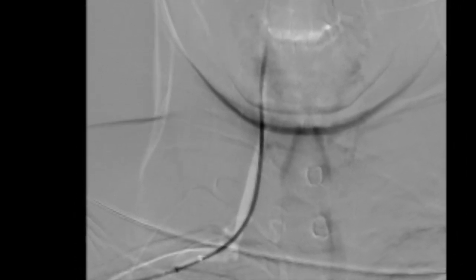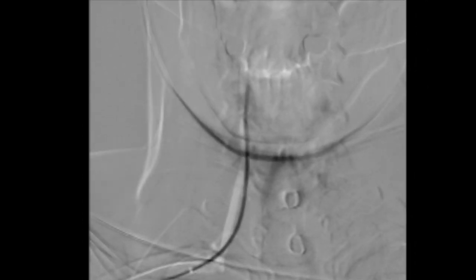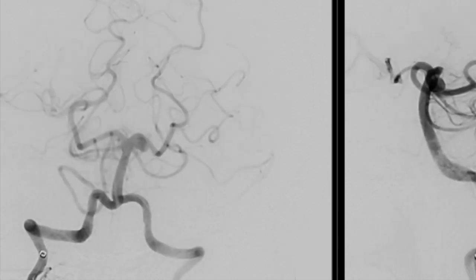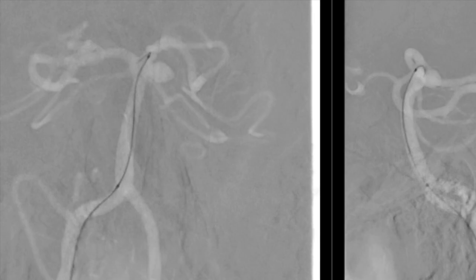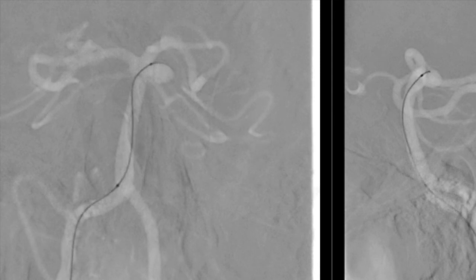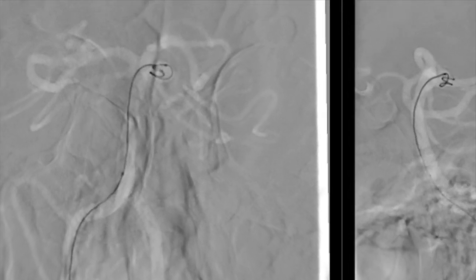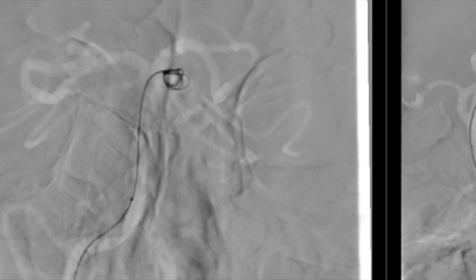And here we go up the right vertebral artery, and there's the intermediate selective catheter giving us access, followed by the guide catheter. And we're going to put that up basically at the bottom of the patient's skull, and then we do the injection, which shows the aneurysm there. And the software and the technology we have is really cool. We basically can make a run of the contrast going through the blood stream, and then we can make a map, which you see here, which is why it's kind of whited out there. It's a map of the patient's blood vessel.